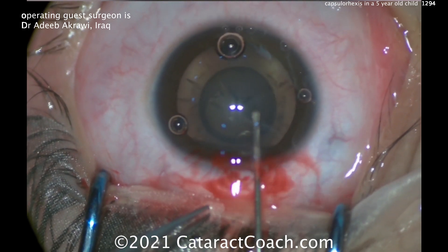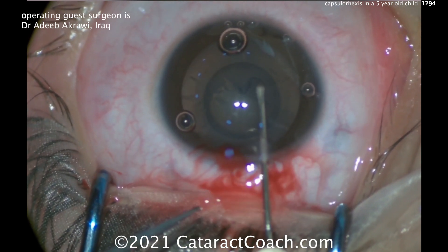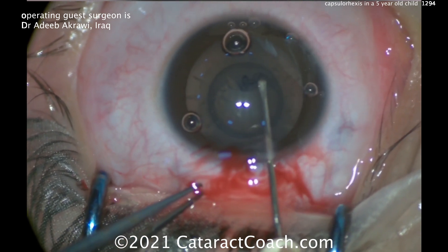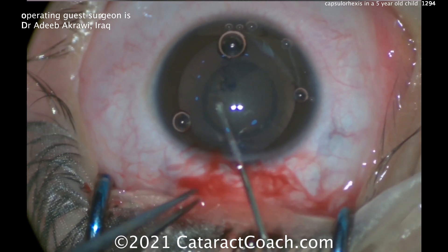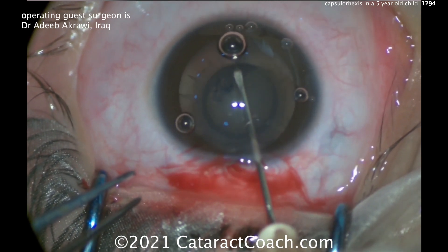Notice how he's doing the whole rexis without forceps, just with the cystitome. That allows going through a small incision — you have no gaping of the incision. Notice how he takes his time. The angle he's pulling is inward more than you would in an adult, because of the capsule elasticity.